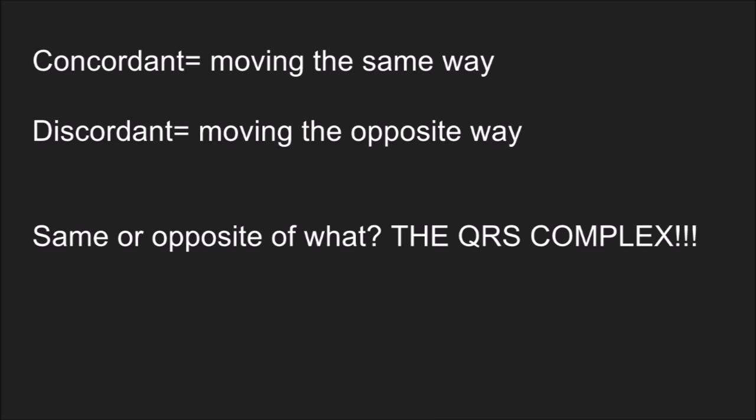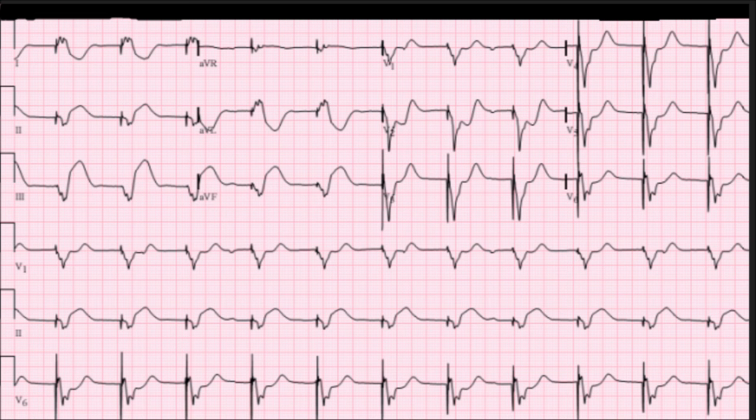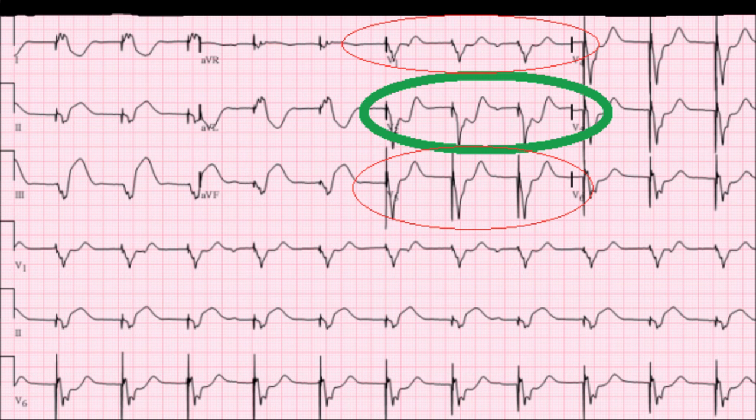Same or opposite of what? The QRS complex, of course. So let's have a look at this and see if we can identify Sgarbossa's criteria. If you look at V1, V2, and V3, we have concordant ST segment depression. If you were to flip this up — if this were a mirror image — it would be a STEMI. This is sometimes a pretty good indication there's a posterior wall MI. It is definitely a positive finding, positive for Sgarbossa's criteria. And anytime you see this in conjunction with the signs and symptoms of an MI, you're probably looking at a transmural MI.